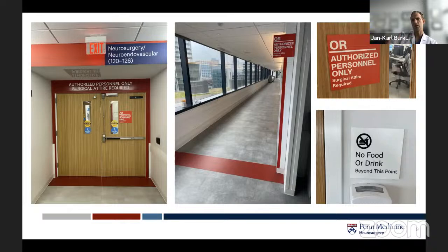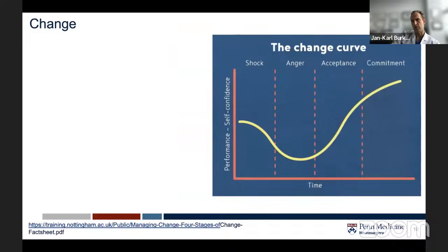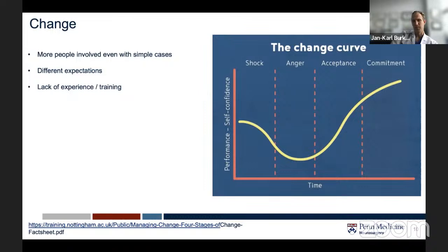If you talk about challenges, when we started in October 2021, all the physicians and fellows were very excited about this change, with the opportunities of the new machines and new setup. But we quickly realized that there are also challenges, and after a few months into this new system, we really figured out that there were things we had to address. Since more people are involved with simple cases, there are different expectations between the different stakeholders. There was a lack of experience and training because, for example, OR nurses were not experienced with endovascular.